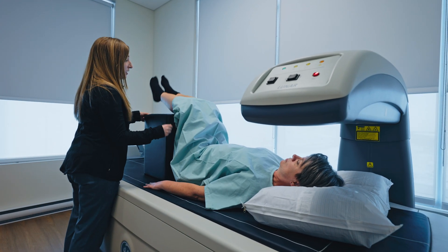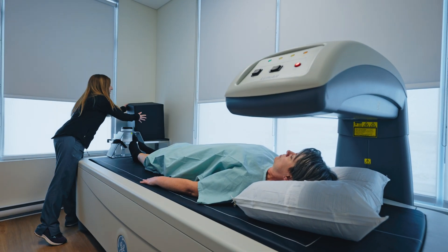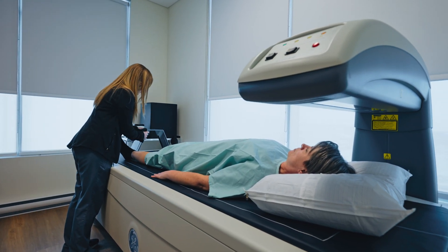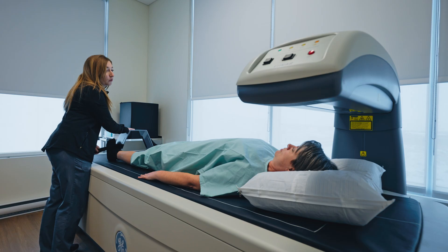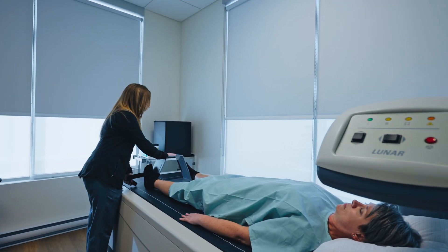Alright, just lift your legs up. You can straighten them down on the table. I'm going to take a picture of your hip now. I'll get you to move your feet apart nice and wide. Good. I'm just going to place this block in between your feet. Turn your legs in so that your feet are touching the block. Are you okay if I strap your feet in to help you hold that? Yeah, that's fine. Great. I'm just going to unstrap your feet here.